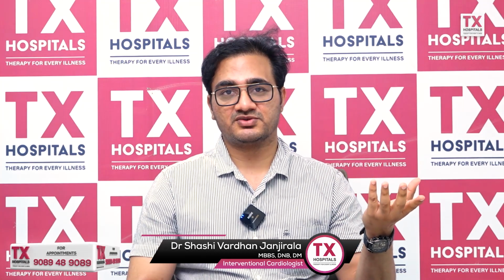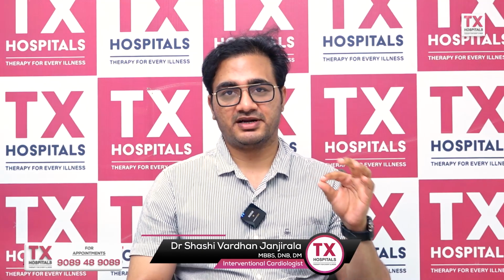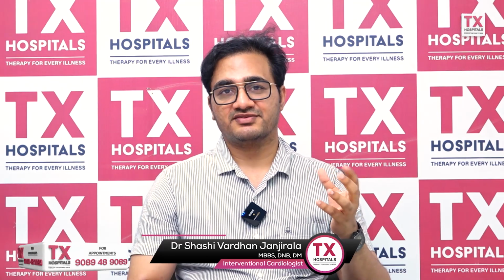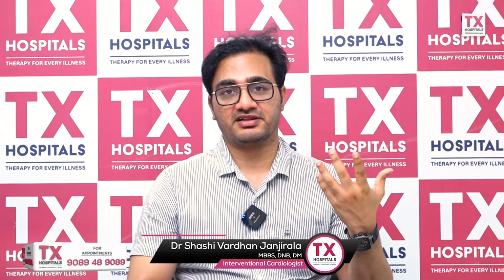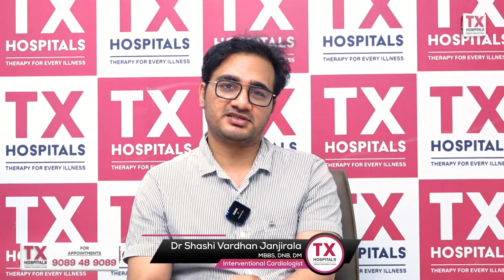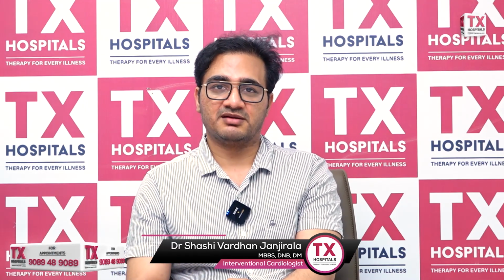And another thing, we usually place stents in the renal arteries also. The blood vessels which take blood to the kidneys are the renal arteries. If the renal arteries occlude, the patient presents with pulmonary edema, that is sudden shortness of breath. In medical terms, it is known as flash pulmonary edema. In flash pulmonary edema cases, we evaluate the patient. These patients usually present to cardiologists, or they might present to a pulmonologist or visit general physicians.